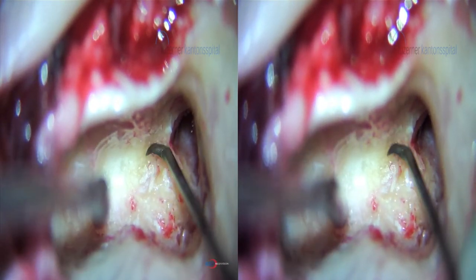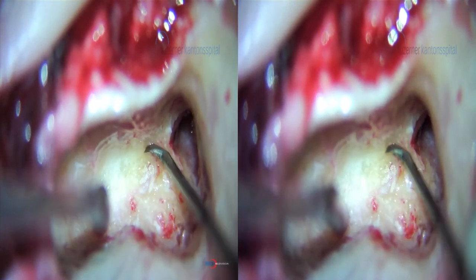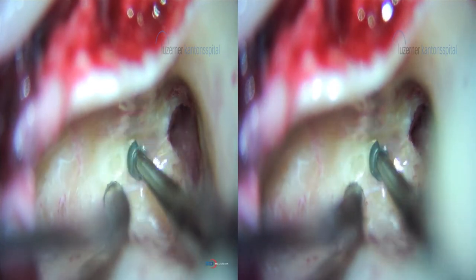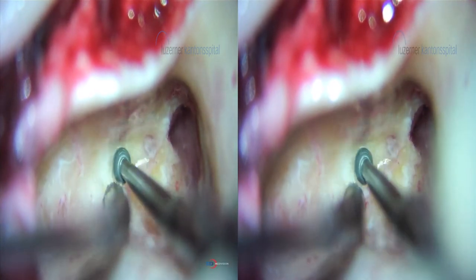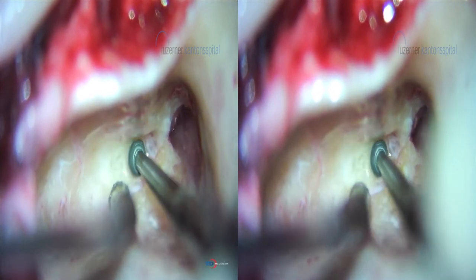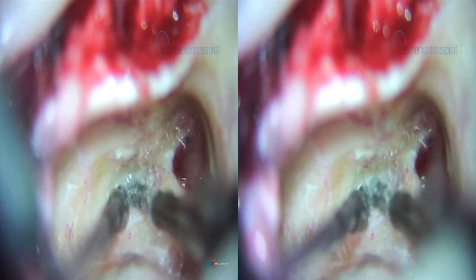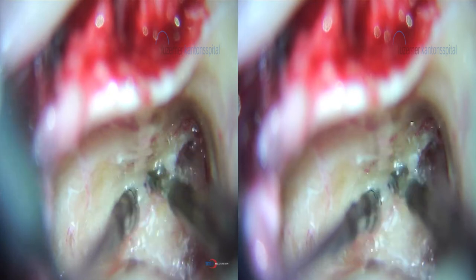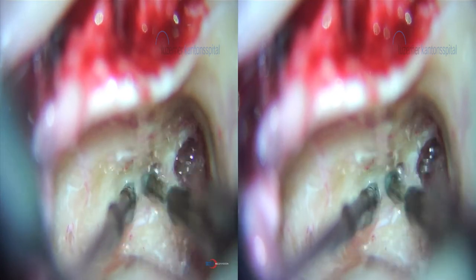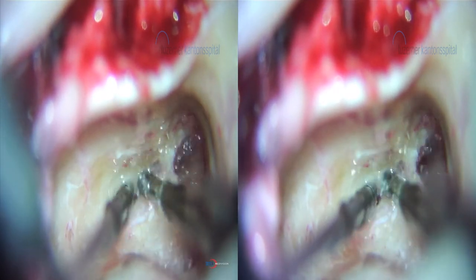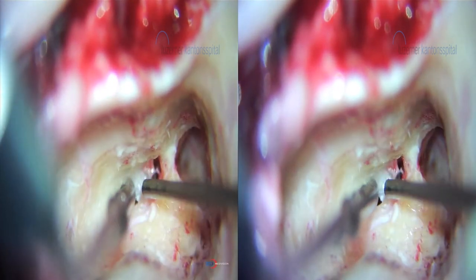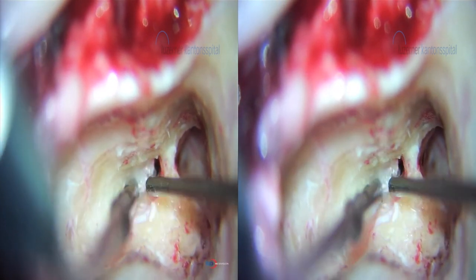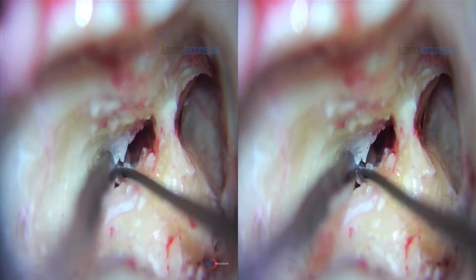Again the course of the facial nerve. We stay very close to the facial nerve avoiding opening the posterior canal wall. This is why we always identify the facial nerve before we open the posterior tympanotomy.